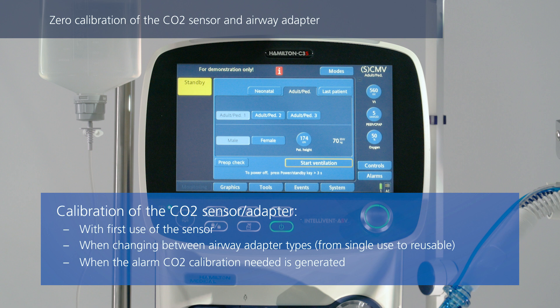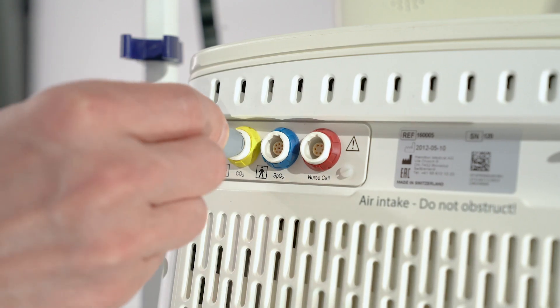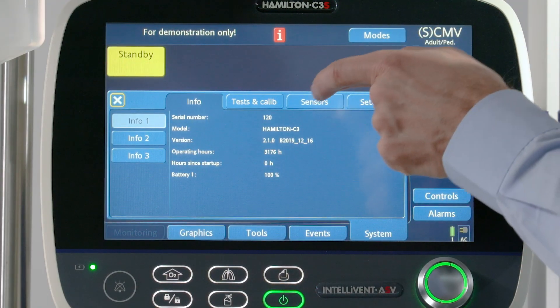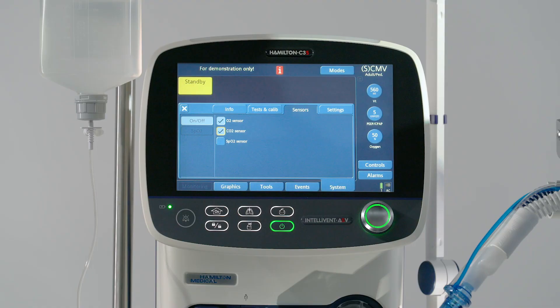When the Disconnect Patient message appears, disconnect the test lung. When the message Tighten Patient System is displayed, block the opening. After completing the tightness test, the message Reconnect Breathing System is displayed. Reconnect the breathing system.